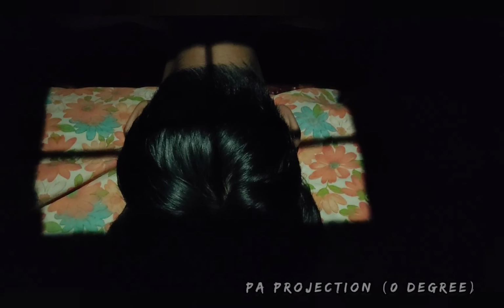PA projection, skull, or 0 degree CR. Patient position is erect or prone. Part position: align the OML perpendicular to the IR. Align the MSP perpendicular to the midline of the table. Then the CR is perpendicular to the IR, parallel to the OML, and is centered to exit at the glabella.